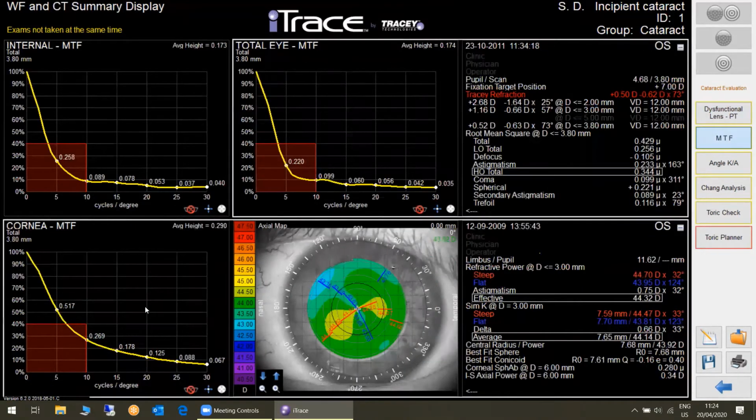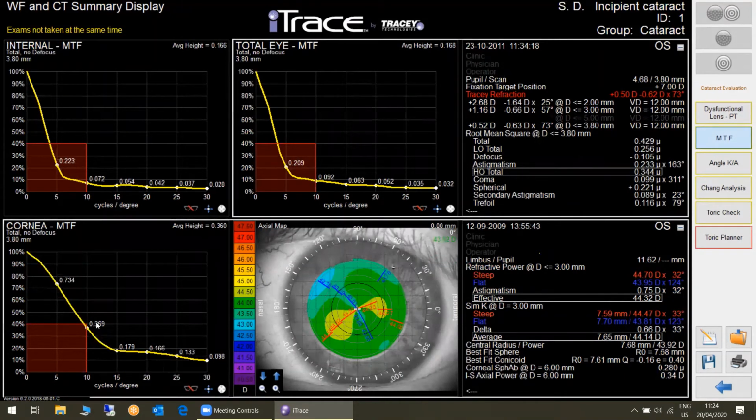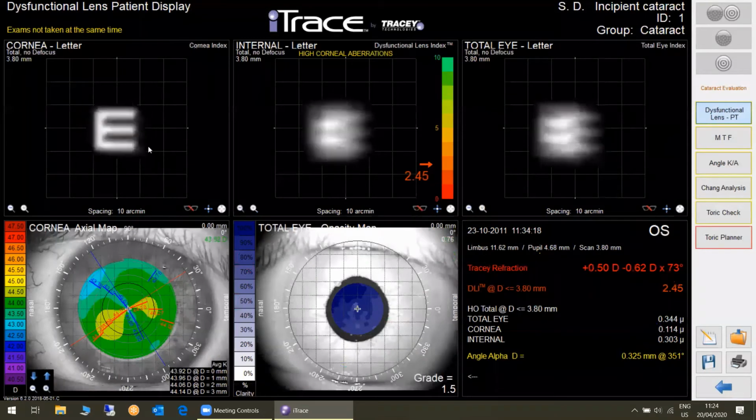But in cataract surgery, you aim for emmetropia. So I take away the sphere. Now we are at 0.37. Okay, 0.37. And this is how a 0.37 looks like. Okay, is this good? Well, I mean, you can drive a car, and if you walk on the street, you will probably not bump into people. But do you think that this is a good medium to put a multifocal lens behind? I don't think so.